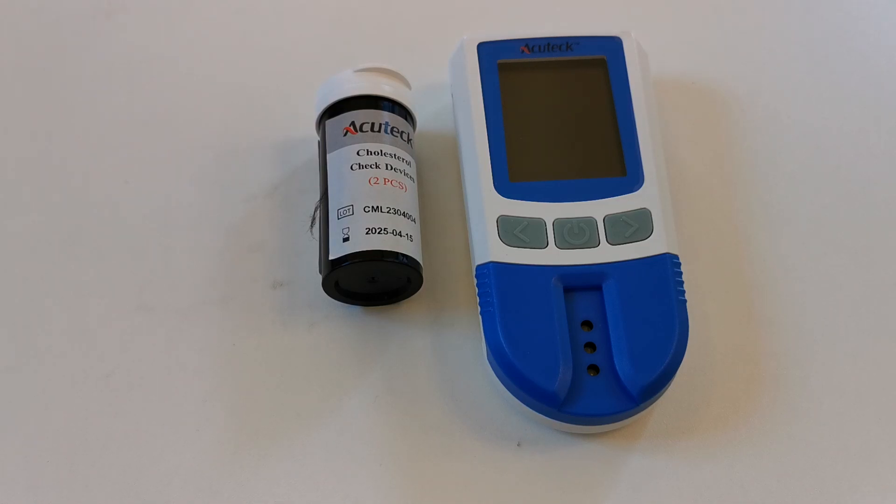Welcome to this Valumed presentation video on how to run a check device test on your Acuteck or EcoTest 5-in-1 cholesterol meter.